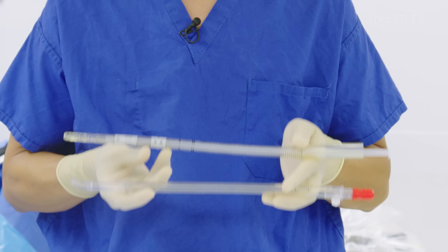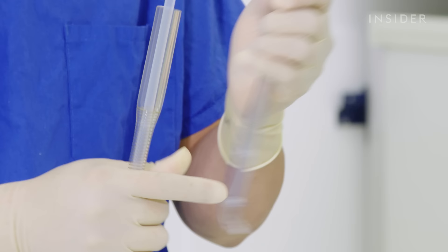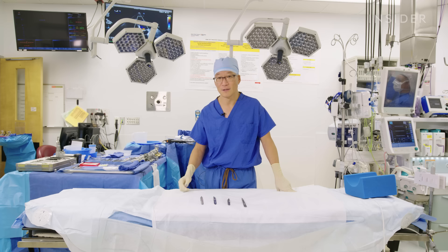These tubes are called cannulas, and these are what we insert directly into the heart to divert blood away from the patient to the heart-lung machine, which will be life-sustaining while we're operating on a still and non-working heart. All these holes allow for the blood to leave the body and go to the heart-lung machine in an uninterrupted fashion.